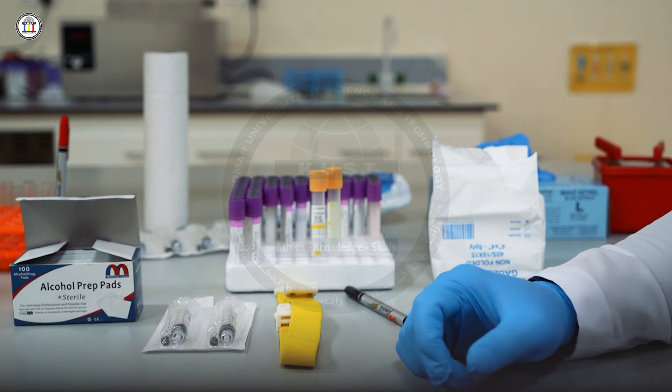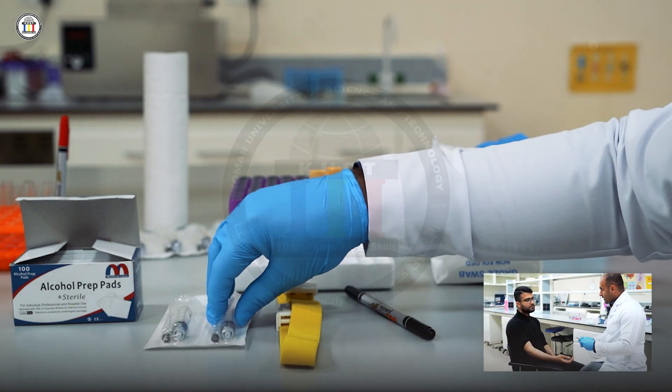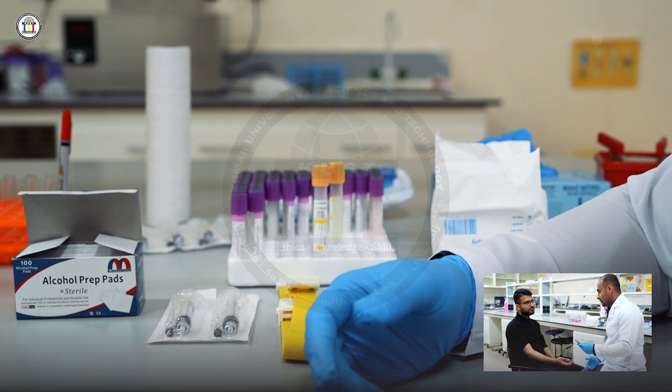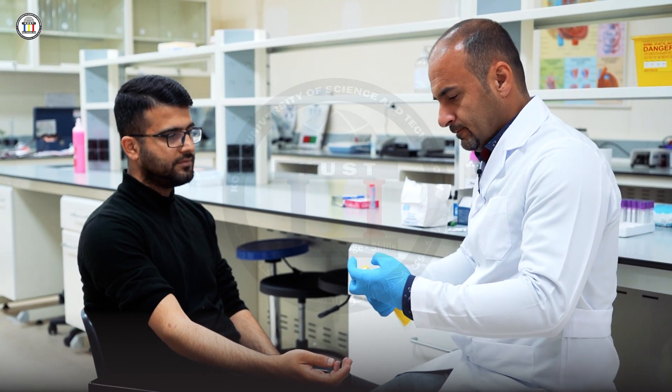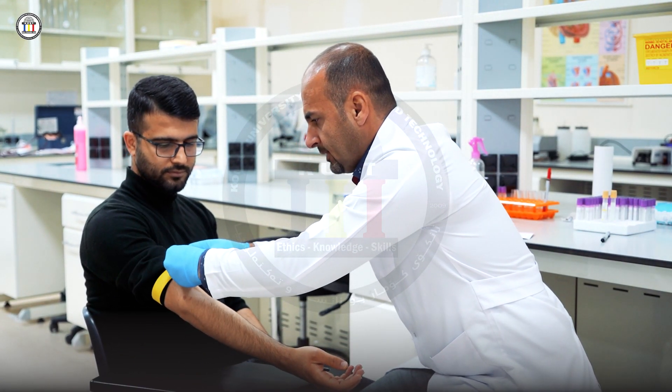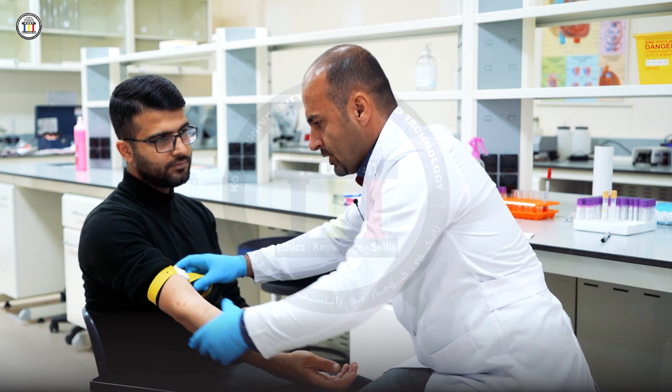Regarding the procedure, you need a patient. After that, you have to explain the procedure briefly to the patient, then you can start the drawing based on the physician's order. So I'm going to draw blood from you — will that be okay? Let's check your identification. I'm going to make a puncture here, would that be okay with you?